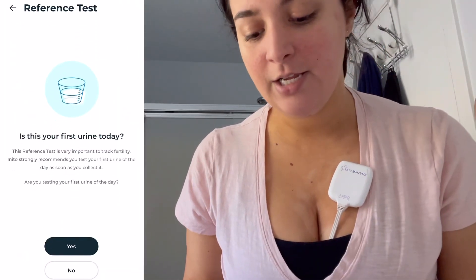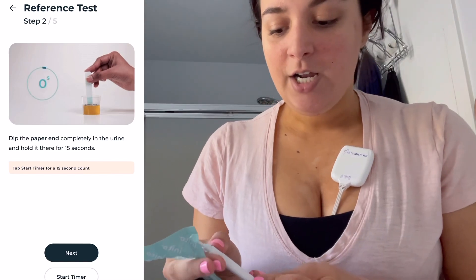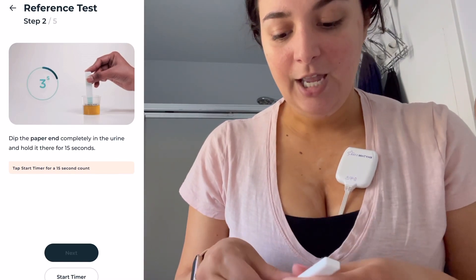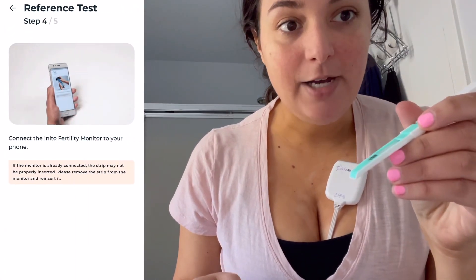The app walks you through everything. It even puts a little timer for you, and then once you're done you would take this off, put the cap on, and this is what you would insert into the back of the monitor.